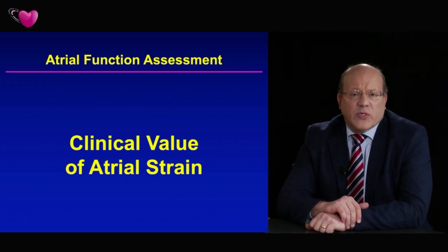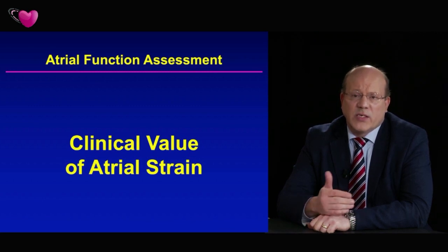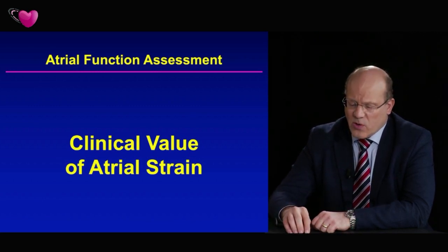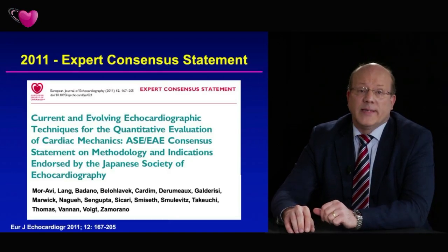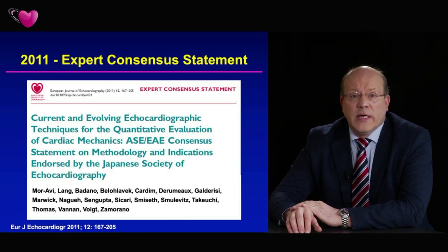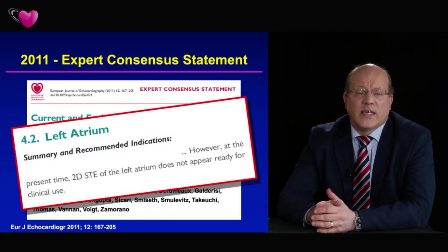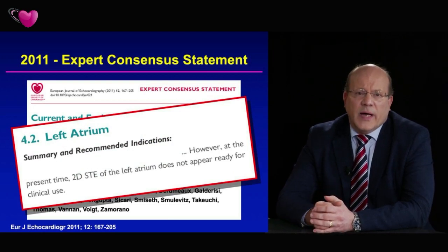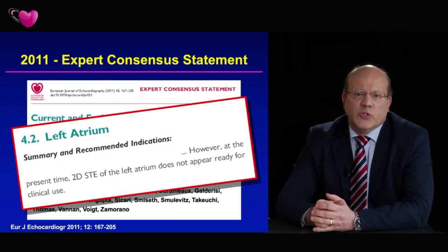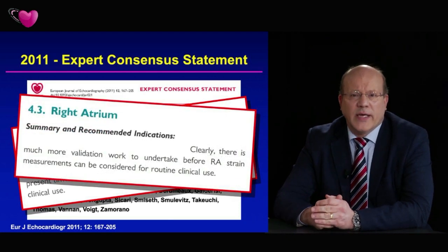So now we come to a more difficult question. What is the clinical value of atrial strain? It's a rather new field of research, although there is growing interest in it. And there are several studies that have looked into that, although when we think of our own expert consensus statement that we wrote in 2011, then at that point in time, we clearly stated that left atrial strain is something that is not ready for clinical use, and very similar wording was used for the right atrial strain.